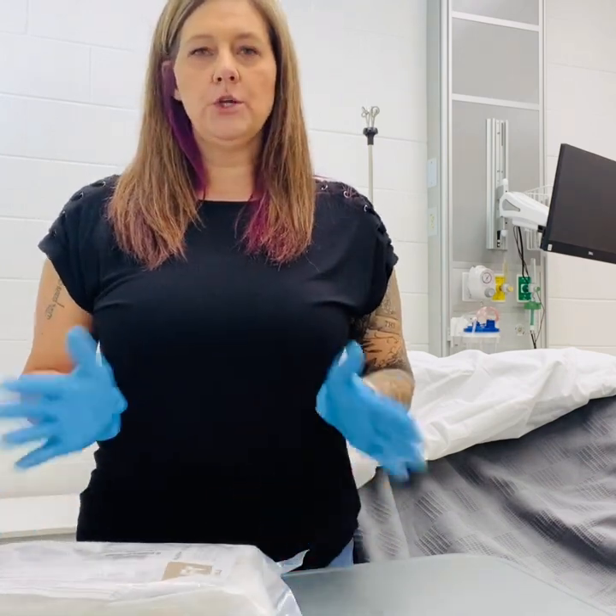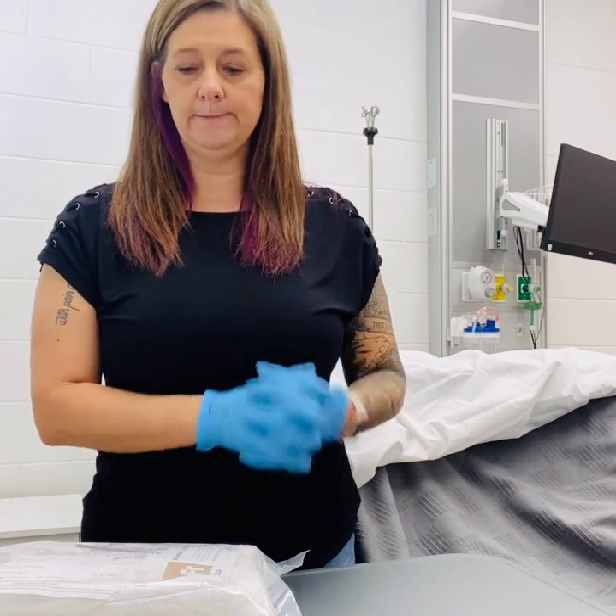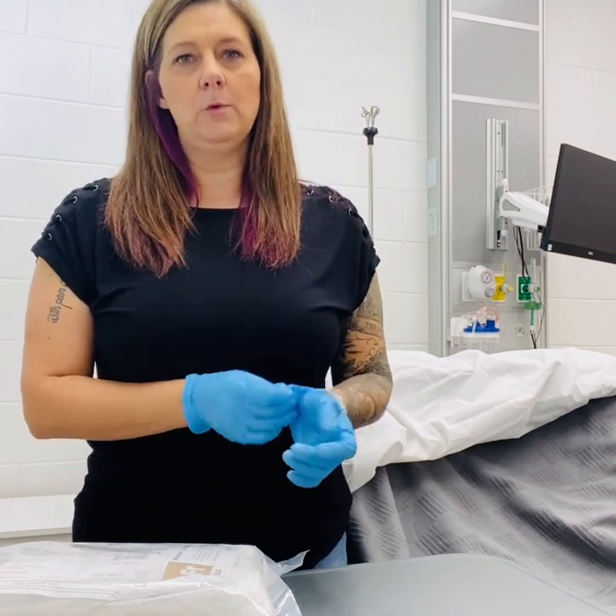You'll want to first wash your hands and apply clean gloves, and then we want to provide perineal care prior to beginning Foley insertion. Once that's complete, we'll remove our gloves and cleanse our hands again, and then we're ready to begin.